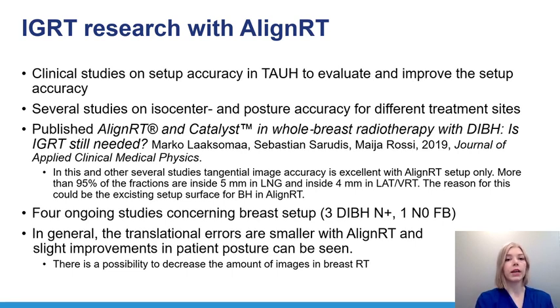And we have 4 ongoing SGRT studies at the moment, and 3 of those concern DIBH with breast and lymph nodes or mastectomy, and 1 concerns the region of interest of the free breathing breast group. Those studies have given us valuable information for improving our setup workflow, and hopefully we can publish them in the near future.